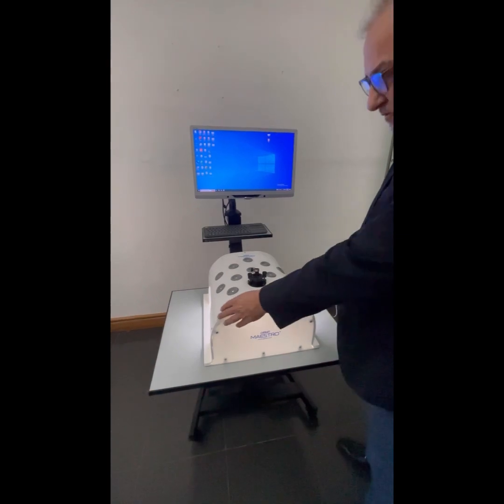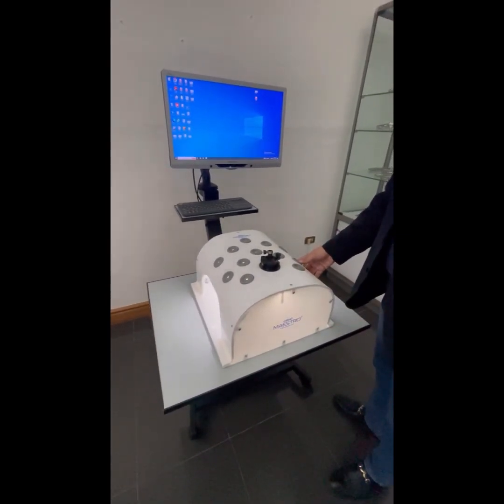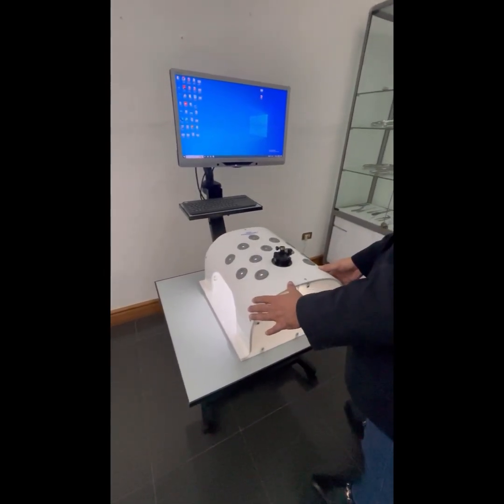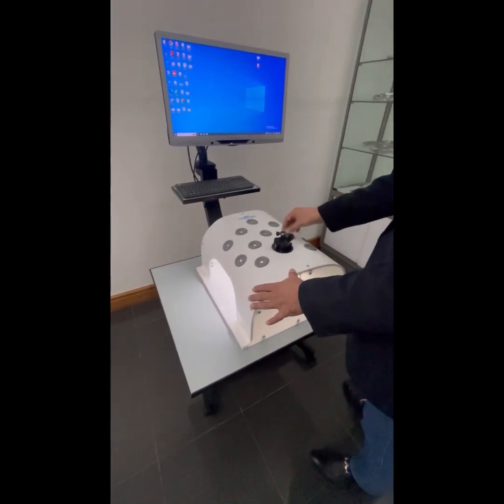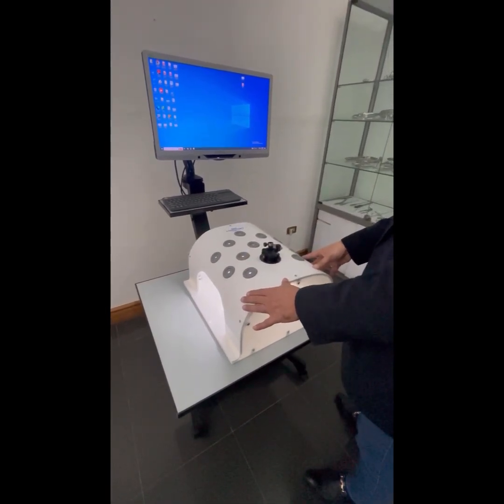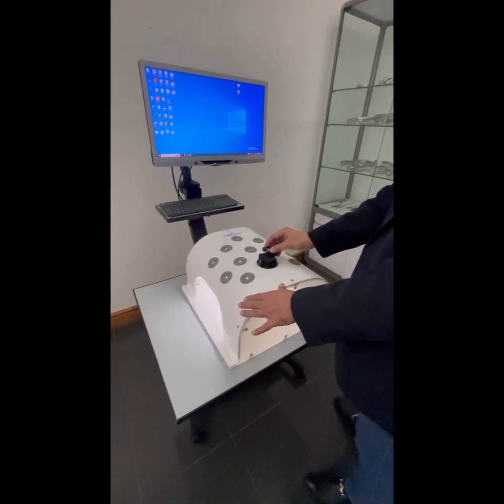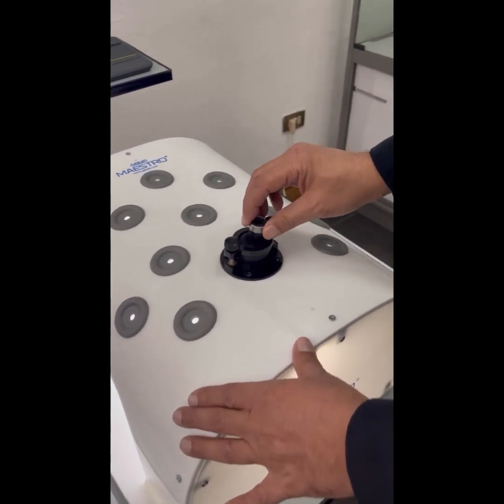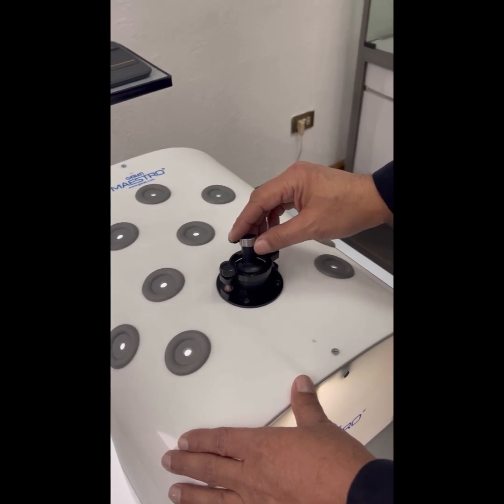This is our training box. The size is about 18 by 13 and about 8 inches in height. It comprises a closed abdomen-like box with about 12 instrument insertion ports, which are strategically placed to represent a surgical simulation. It has a camera navigation system that comprises a rotatable ball and caters to training for one or two persons.